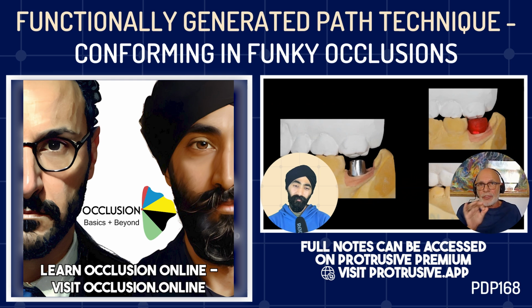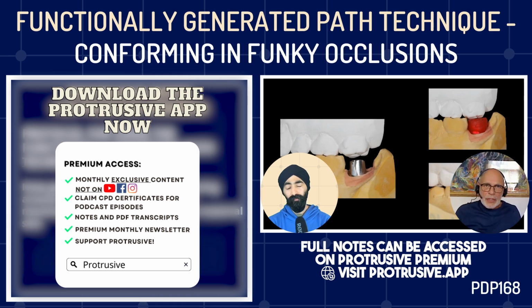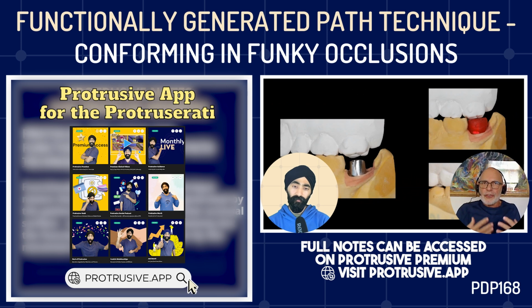And then you mix the resin, you place it all over the occlusal table, you get the patient to close, and then start grinding around in all their excursive movements. Maybe put a little bit of Vaseline on the opposing tooth, because the acrylic can sometimes stick to it. You keep getting the patient to move around, tap, tap, tap. Whatever excursive movements they can make, get them to do it until it sets. And that is what functionally generated means.